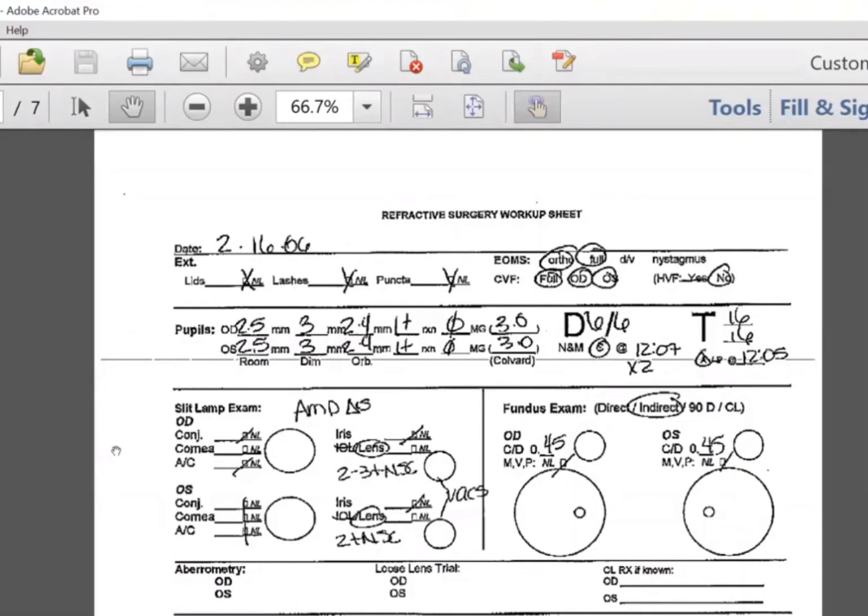Right, so tonometry is performed before surgery to do screening for certain eye conditions. Tonometry is also done after cataract surgery to check the eye pressure. In case there are intraocular pressure spikes after surgery due to OVD that's not completely removed, this is a way to take that measurement and to get an idea about whether there are excessive pressure spikes in the patient. It is not good to have excessive pressure spikes, because that causes a lot of patient discomfort.